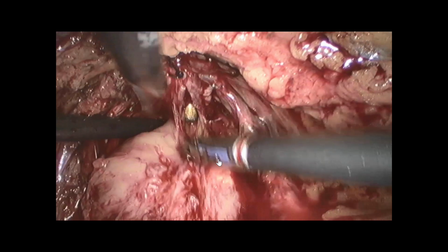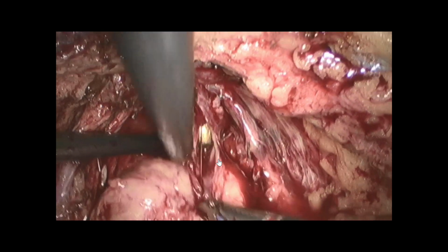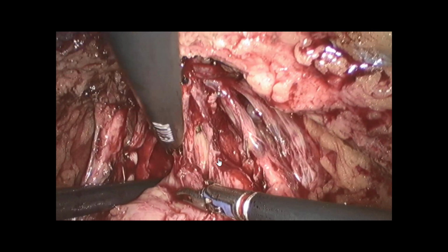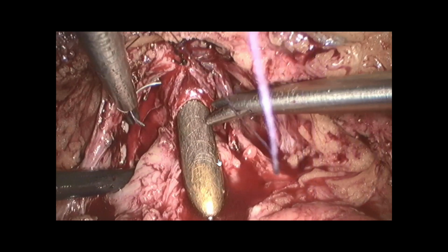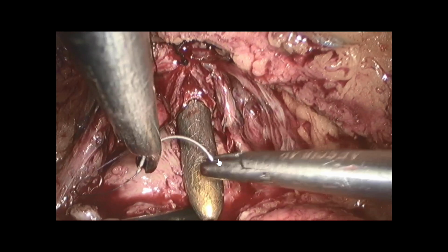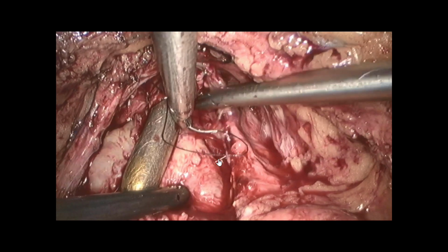Very important for me. And the second thing is to add a second layer to fix together this small muscle. Because when you cut here, you have in fact some part of the sphincter attached to the prostate. So I refix together this small thing outside of the urethra, 10 o'clock to 11 o'clock and 1 o'clock to 2 o'clock.